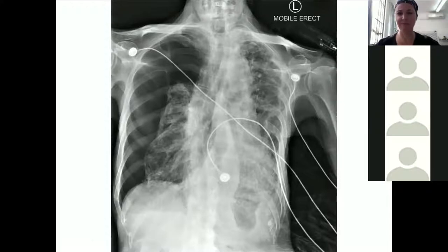Almost all of the answers coming through correct. Okay, let me stop you there. We've got most people getting exactly the right answer there. If you have a look on the right-hand side, so on the right lung, it looks like that whole right lung has collapsed down. And you've got a great example there of what a pneumothorax looks like. So your lung completely collapses down on the right-hand side. Between your lung and your chest wall, you've got a whole pile of free air. And that free air is then pushing the trachea over to the left-hand side. So this is a great example of your trachea not being central, it's being pushed towards the left, and it's being pushed over by that pneumothorax.